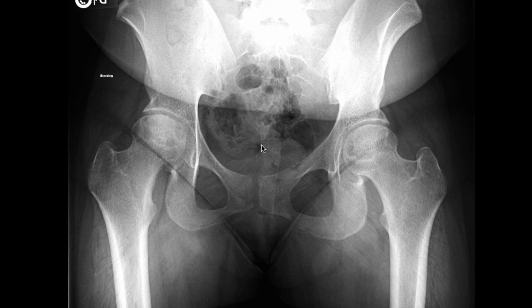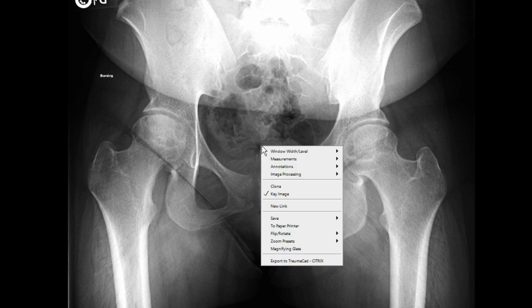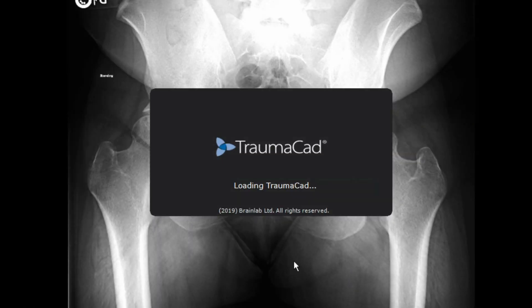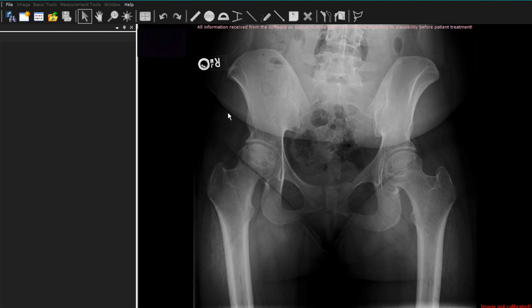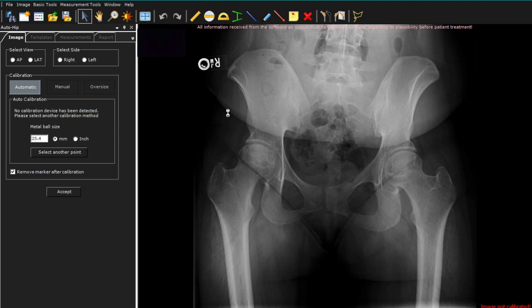You first right-click, which pulls up your menu and allows you to start the software. Now that TraumaCAD is running, you will be able to select the image, which is AP pelvis in this case, and click on the hip icon.